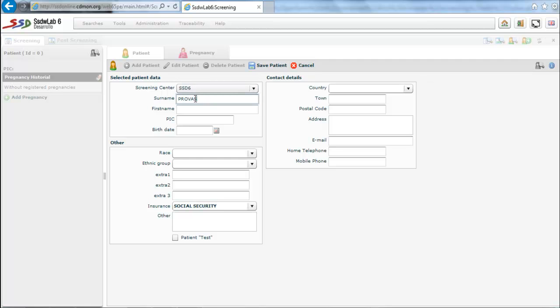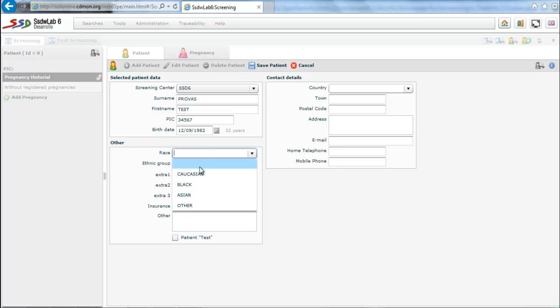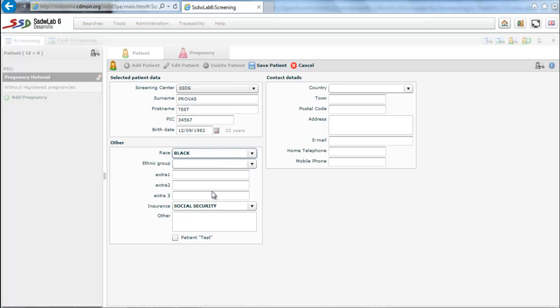In the patients folder we must enter the data identifying the patient: surname or name, CIP, and date of birth that will let us calculate the age of the patient in the section called Others. We introduce the race of the patient, which is a correction factor, and in this case the patient is black. In fact, we mark the patient as a patient test.